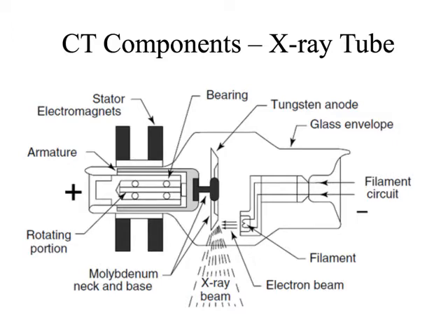But I like these kind of simplified diagrams too. And the big thing here that I want us to take away from it is we've got a positive side and a negative side. And the positive side is called what? Good. And we've got a negative side that's called our cathode, right? So here is our anode side over here. I've circled the positive side, and the negative side is on the right side of the screen.